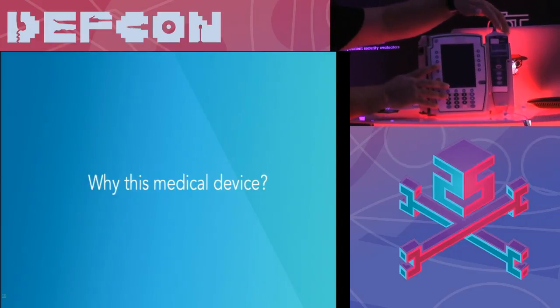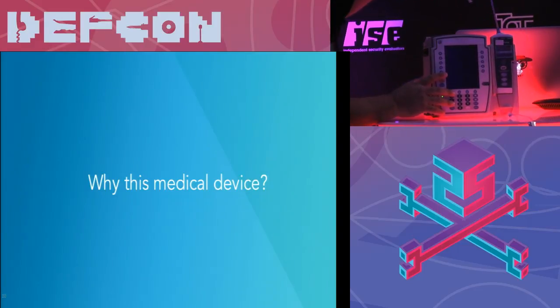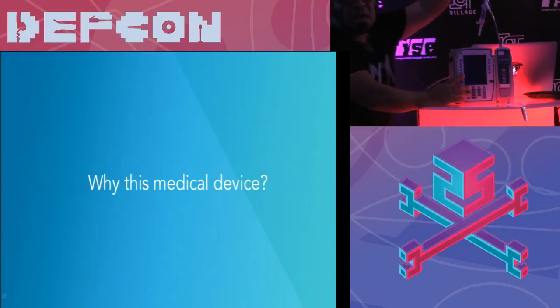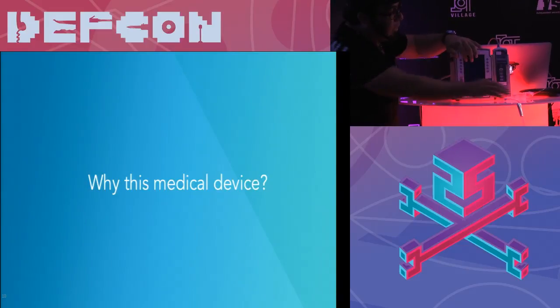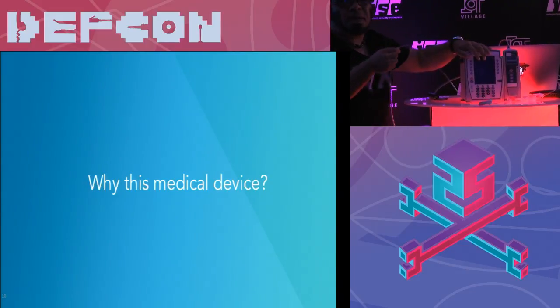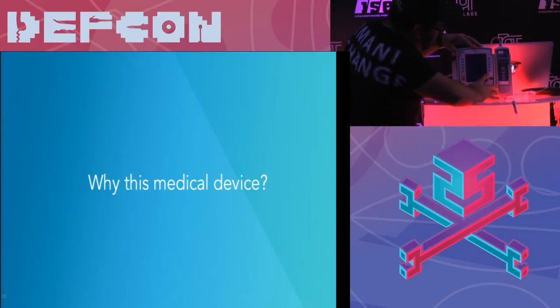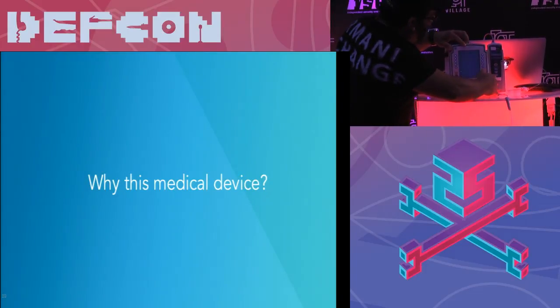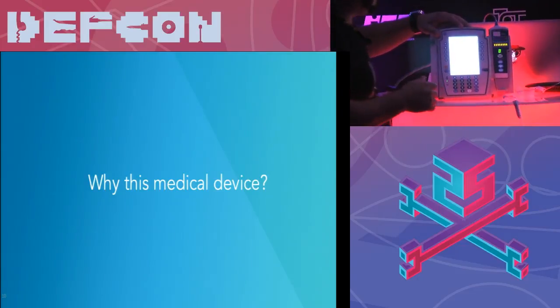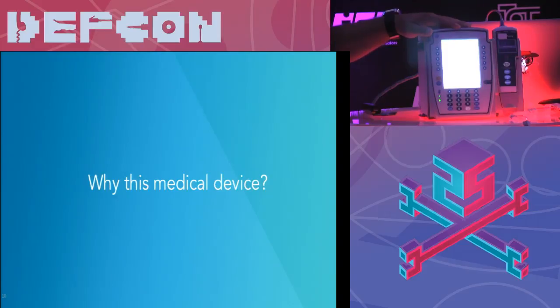On the left side is the actual pump. This is the one that is going to have the bag with the liquid, and on the other side, you have the connection to the patient. Let's just turn it on. It's going to be hard for you to see, but at least you have an idea. I'm going to put it in the back so that we can also talk about details. It's going to boot up.